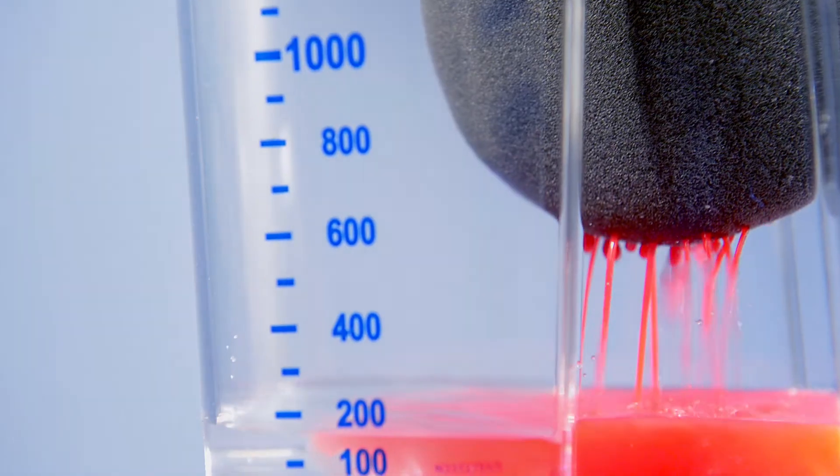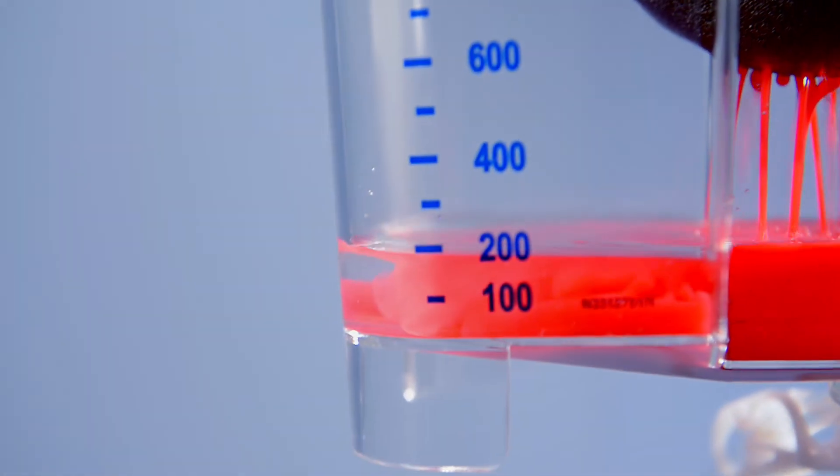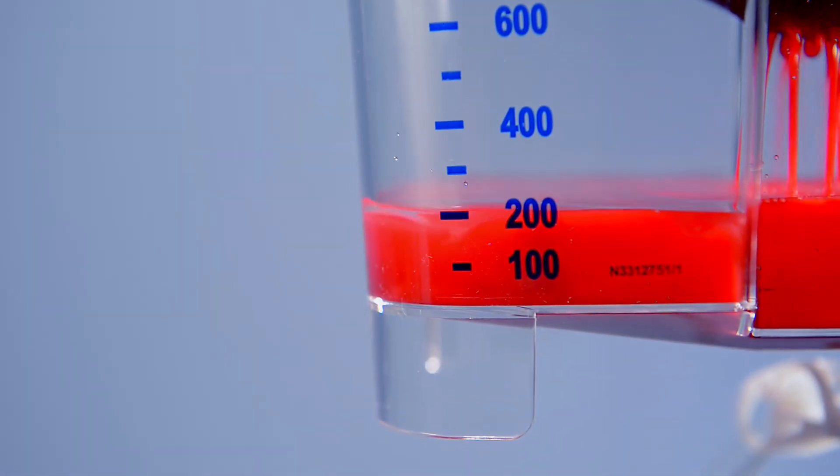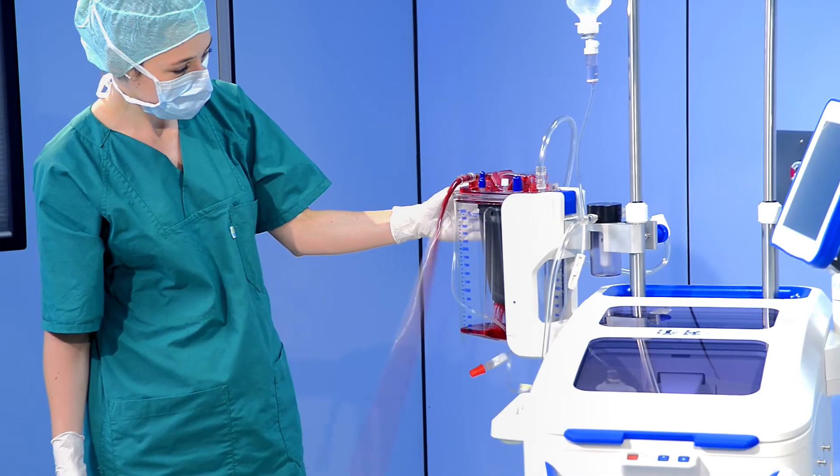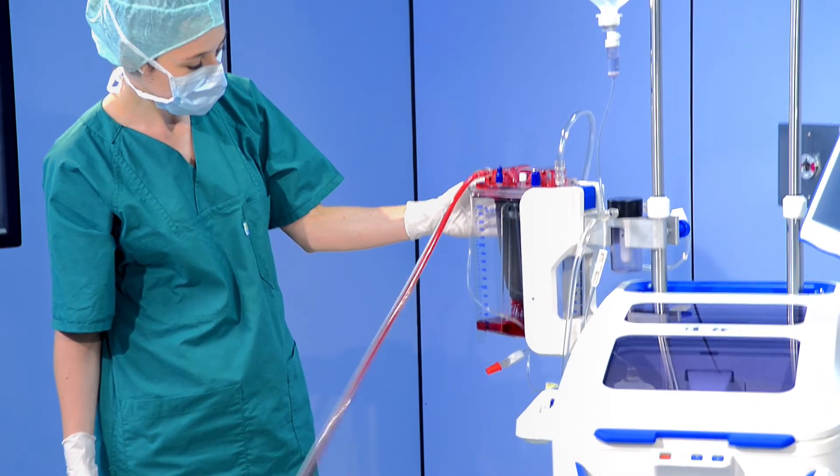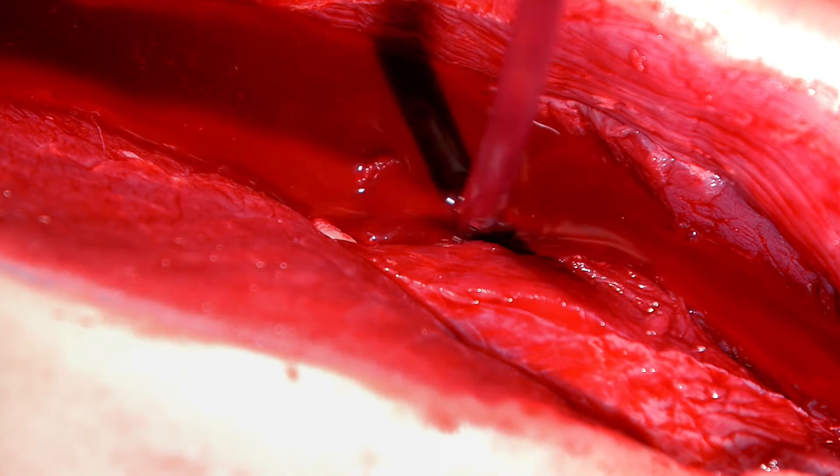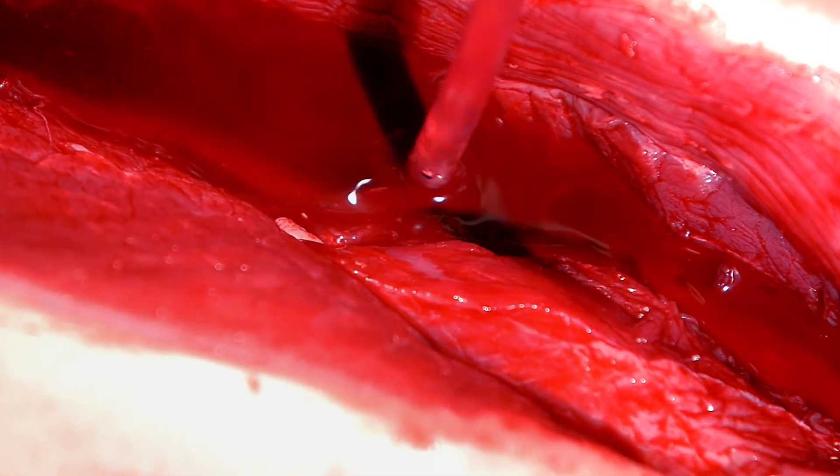Monitor how blood is being aspirated from the wound to the reservoir. Aspiration of too much air in the suction tip can activate clotting and cause hemolysis. Please keep in mind that red cells are very sensitive to shear forces.